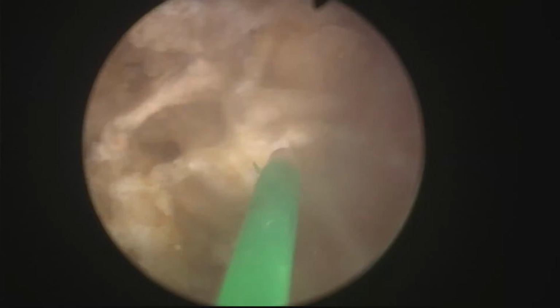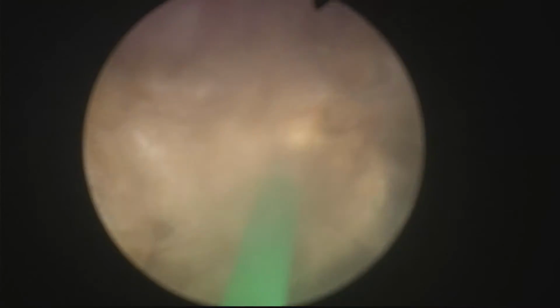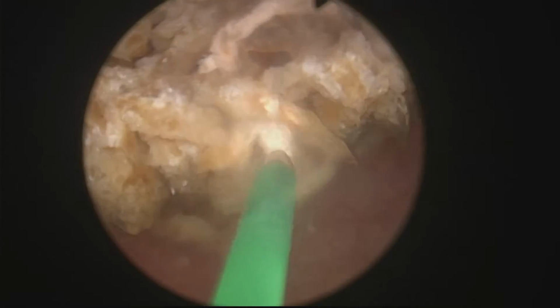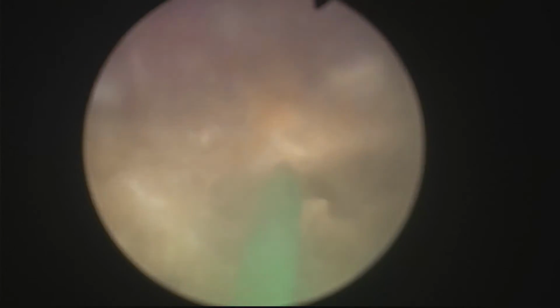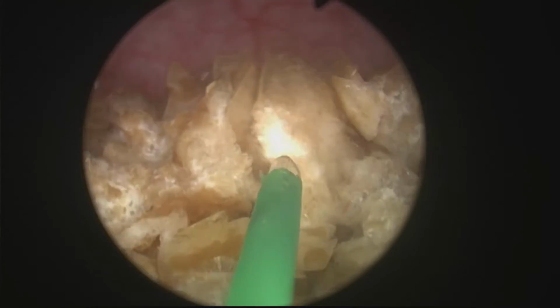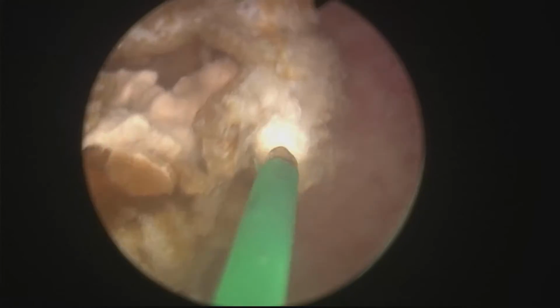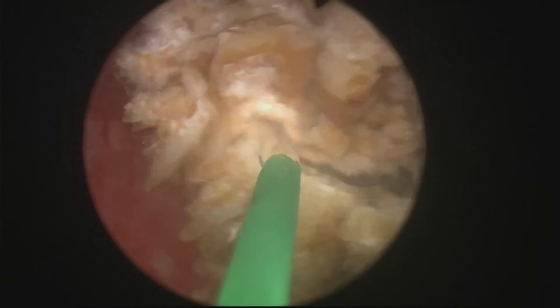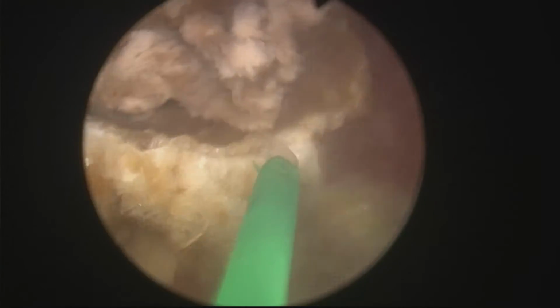I was using 1 joule and 40 hertz, which is the setting that I usually use for coagulation, and the pedal. And to my surprise, there was a biological matrix that probably led to the formation of the stone. As we peeled off the external shell of the stone, we could see that there was some biological material in the middle. So probably a TURP chip left behind at the time of the original TURP operation.